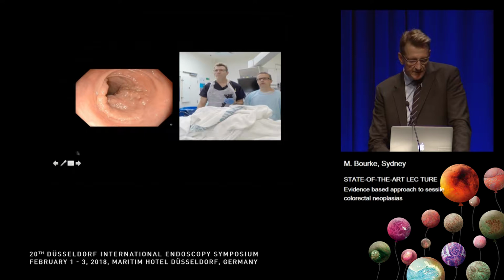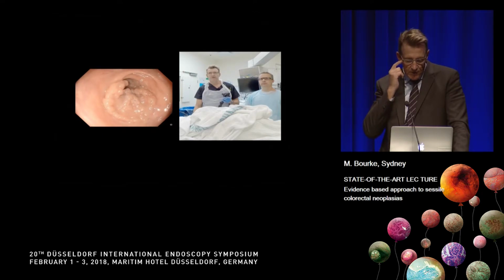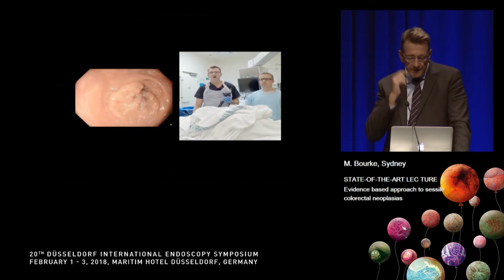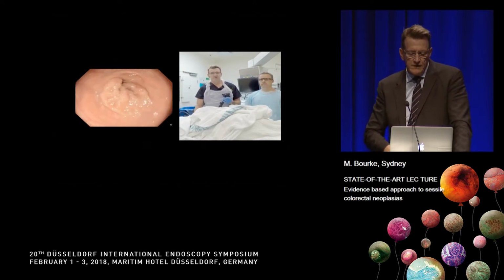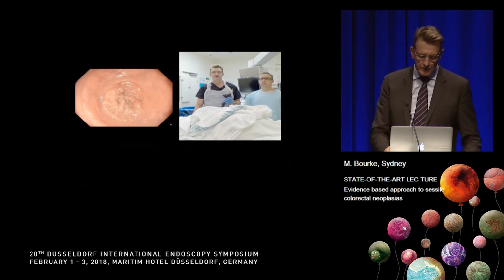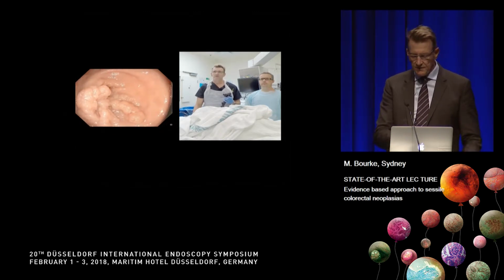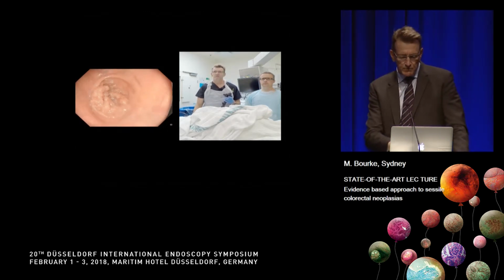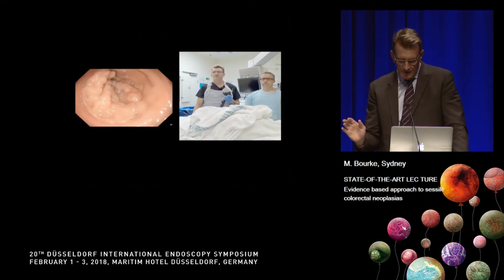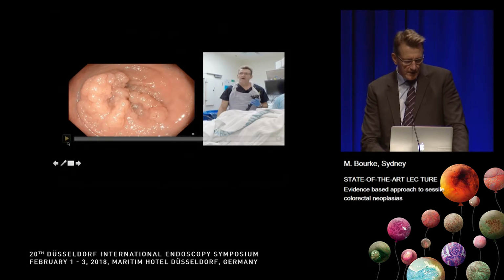So this is a large lesion referred to us. And next to me here is Professor Steve Heitman from Calgary, Canada. He's the Director of Colorectal Cancer Screening there. And this video is really quite disturbing, not so much disturbing because of the size of the lesion, which is 10 centimetres long and full circumference, but the fact that Professor Heitman doesn't blink for the first 15 minutes of the video. So that may be uncomfortable for you, so we just chop him out.